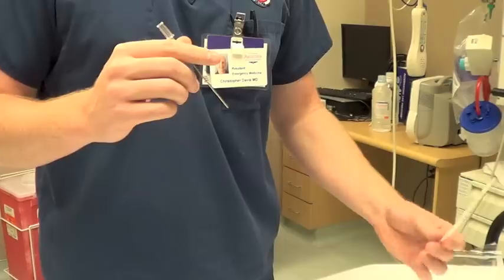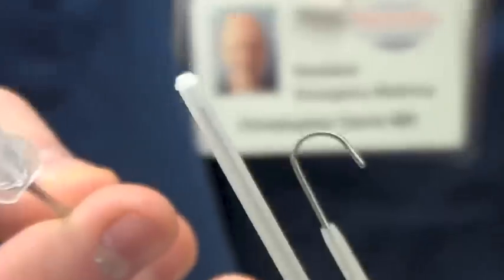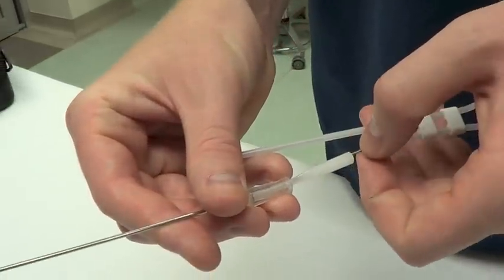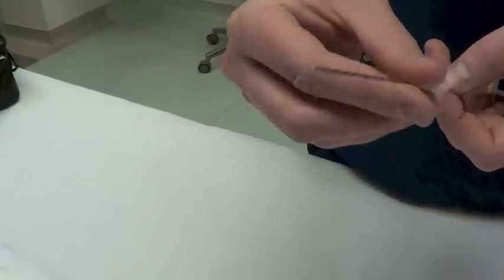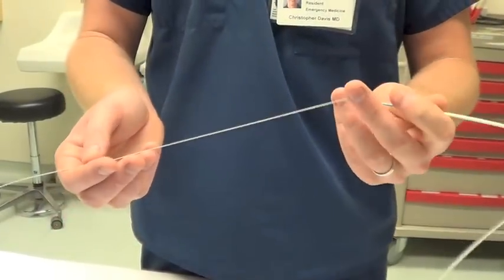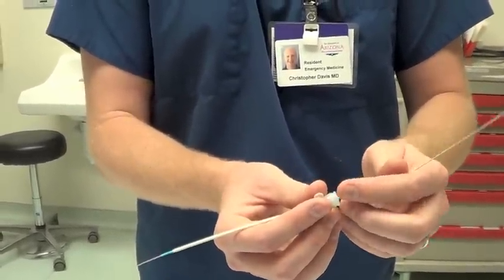Once you've got your catheter in, the next step is the guide wire. This can be slightly tricky because there's a small hole past the piece of plastic that you have to pass the J-wire through. Pull the J-wire up just to the edge and then feed it directly in. With the J-wire fully advanced you'll get no resistance and can easily feed it through the needle. Once your J-wire is in, pull the whole apparatus out, make your skin nick, and pass your introducer sheath like any cordis insertion. Then pull both the dilator and the guide wire out together in one stroke.